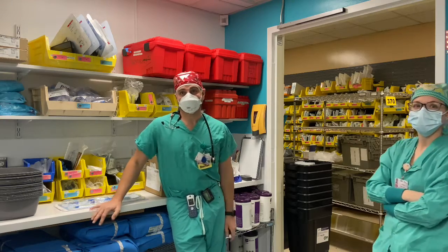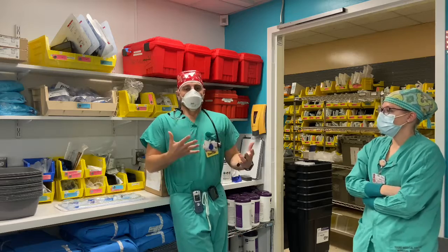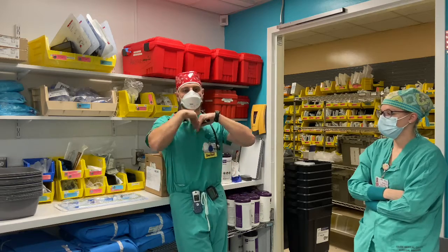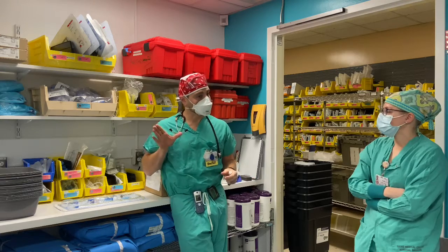Positive pressure is a machine that's pushing air into the tube, right? Yeah, exactly. When you take a breath right now, it's negative pressure. You're dropping your diaphragm, you're expanding your rib cage, and it's creating a negative inspiratory force that's sucking air in. When we have somebody on a ventilator or an ambu bag, we're pushing air in.